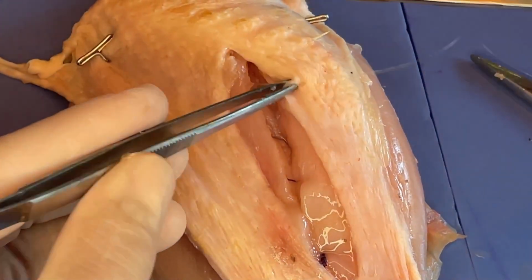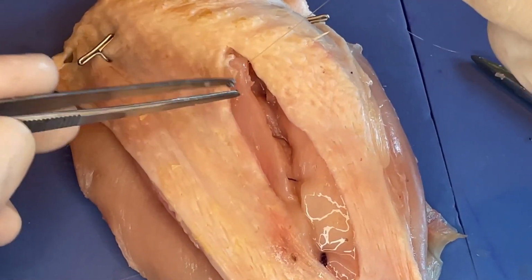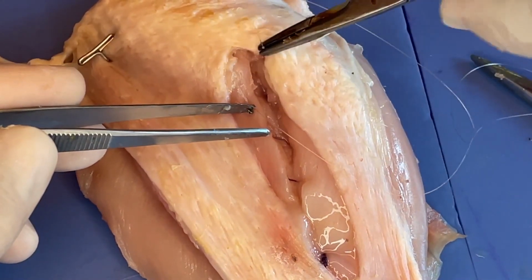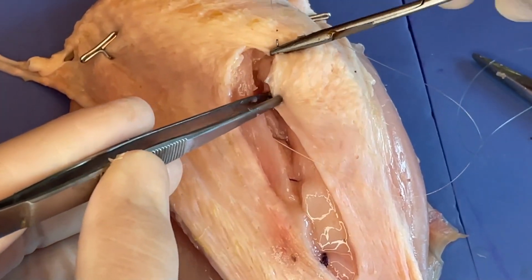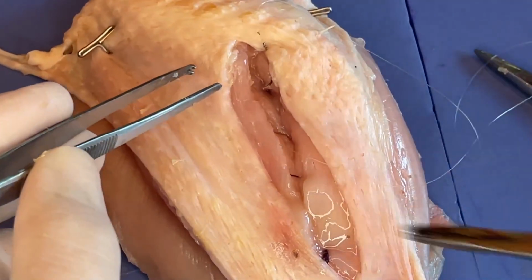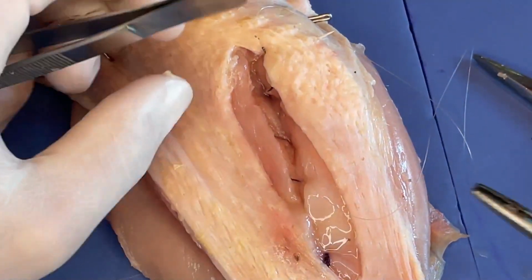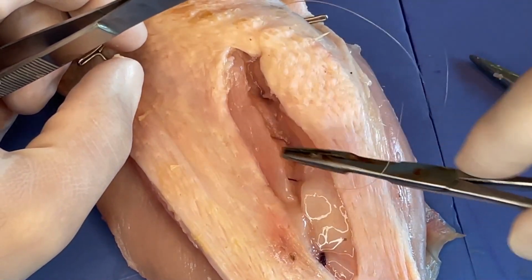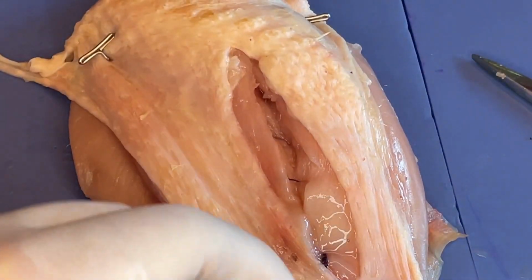But we'll see if we can't kind of simulate this somehow. So if you can see where the suture is here, we want to go directly across from there to start with our next bite. So we would do that, and again, we can kind of grab here, stabilize that skin edge. As we pop the needle out, we'll drive that through just a little bit more. And again, we try not to grab the needle tip itself, because that will really dull it down.